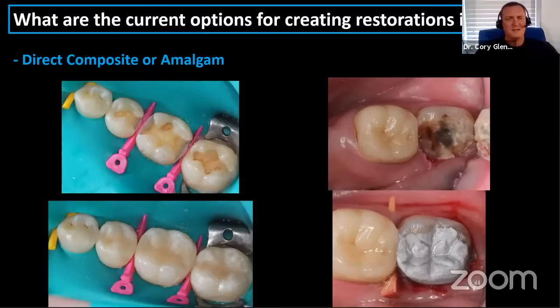cglenn@blueskybio.com. So I'm somewhat recycling a presentation I did fairly recently for the Yankee Dental Congress on some of these new permanent crown and bridge resins that are available for printing. I'm doing that because that's a really practical way, if you're trying to get into in-house design and making your own restorations. I've been extremely impressed with those resins, in particular the Bego Varseo crown. That's the one that's approved by the FDA in the States.